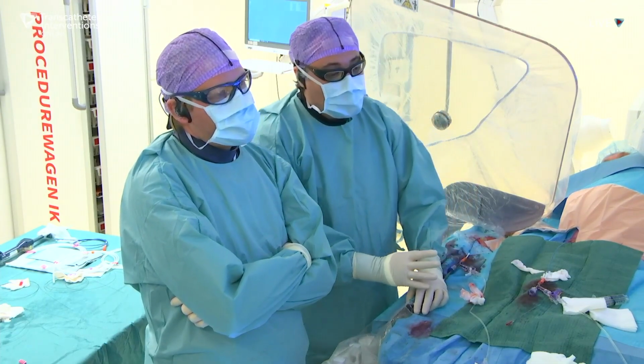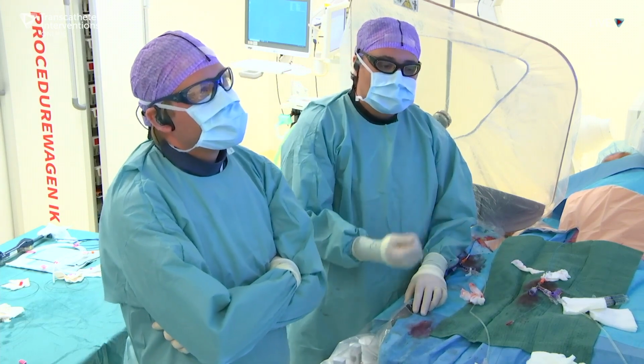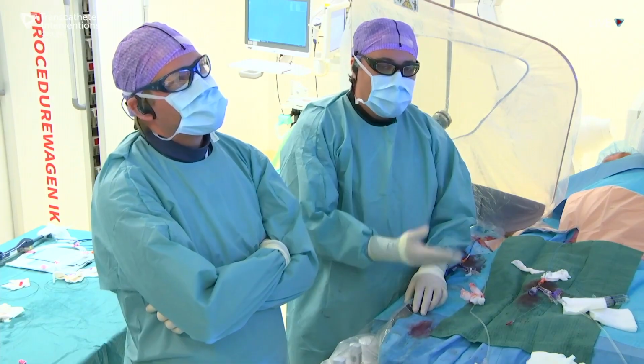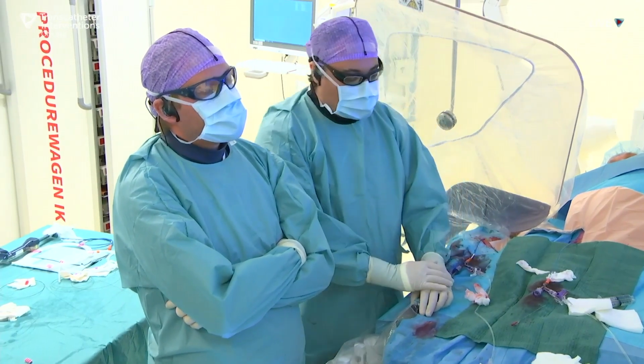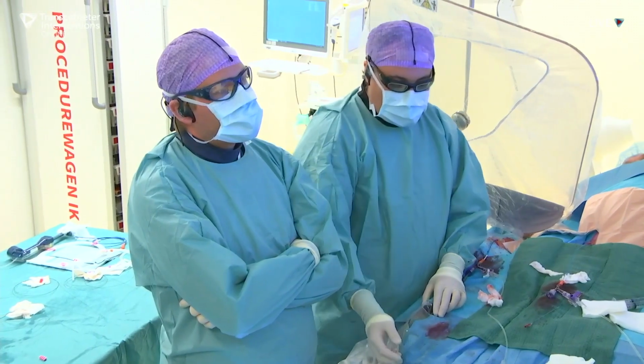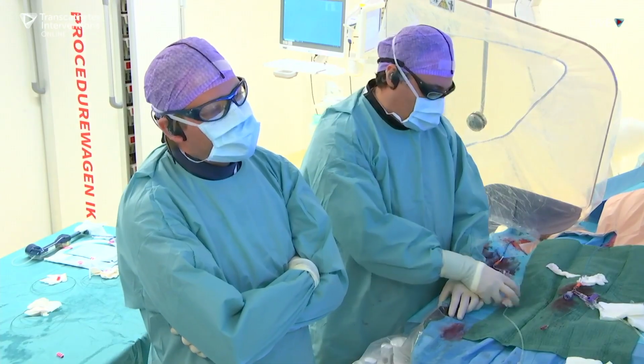So this is very important whenever you do retrograde, but especially for epicardial: when you remove the microcatheter at the end of the procedure, leave the wire in and make a check. That is a very important step for safety. So you can go ahead and keep working.